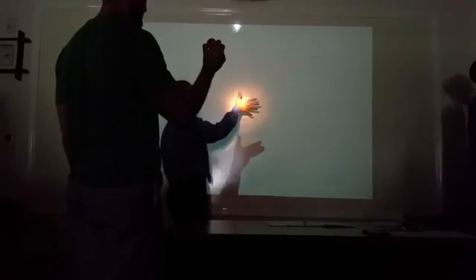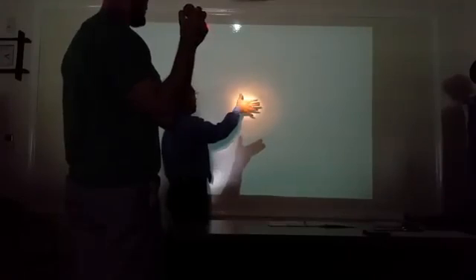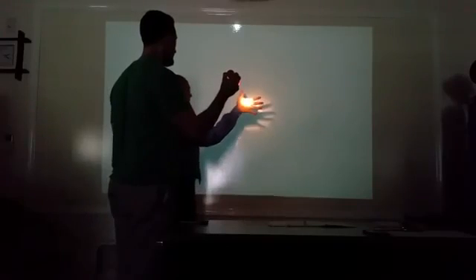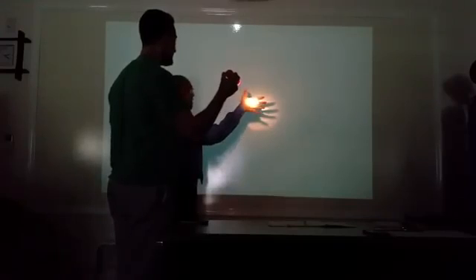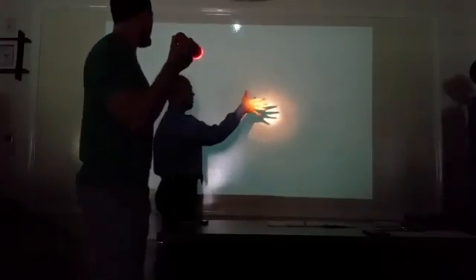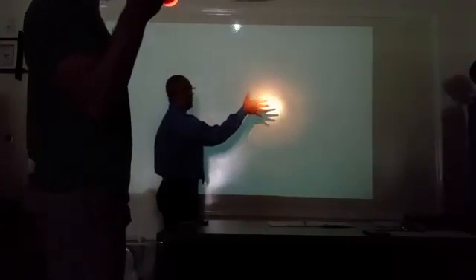Okay. Here's my hand. We're looking at the shadow of my hand. Okay? What happens when you increase your SID? So let's go ahead and pull the tube away. What is going to happen? Here, bring it back a little bit. Okay, stand back right there. Okay, I'm going to be more obvious. Okay, there's my hand. Go ahead and bring the tube back. Keep going. What's happening to the size of my hand? Getting smaller. It's getting smaller. Okay, keep going.